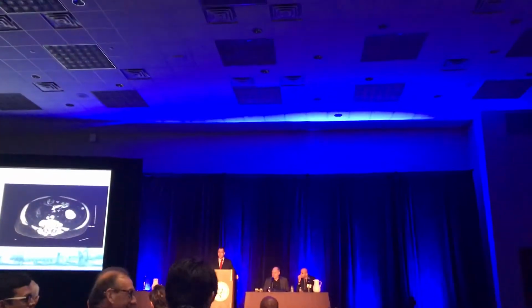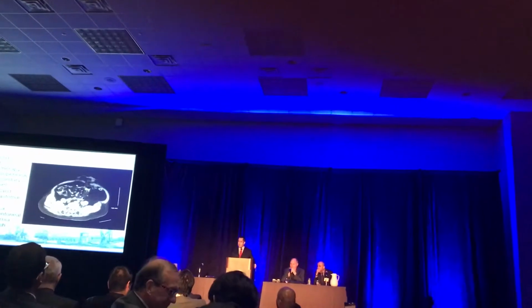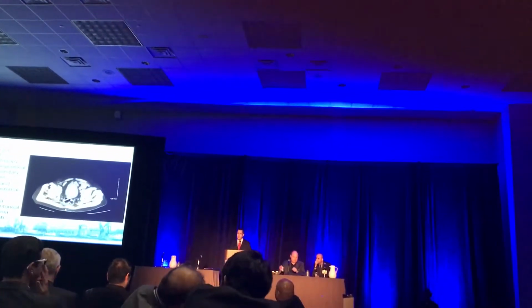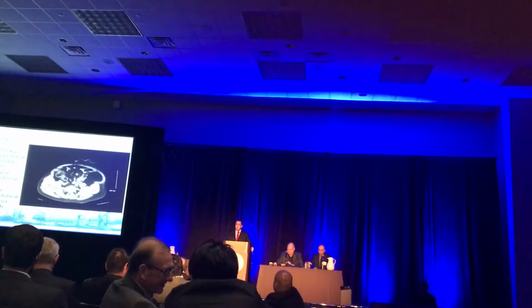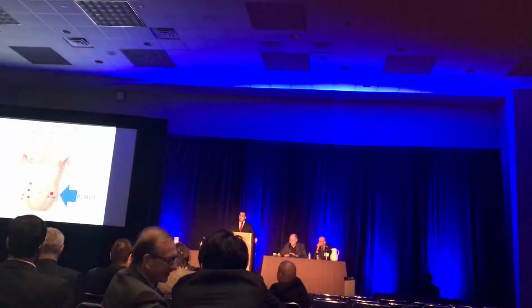So I will start by presenting a patient who is a 75-year-old male who underwent chemoradiotherapy for a rectal cancer followed by an abdominal perineal resection. The patient developed a symptomatic and enlarging parastomal hernia, and therefore he was sent to us. We consented him for robotic pre-peritoneal parastomal hernia repair.